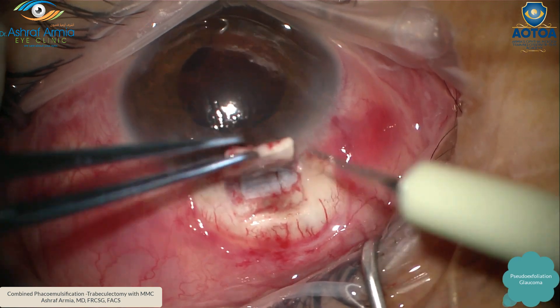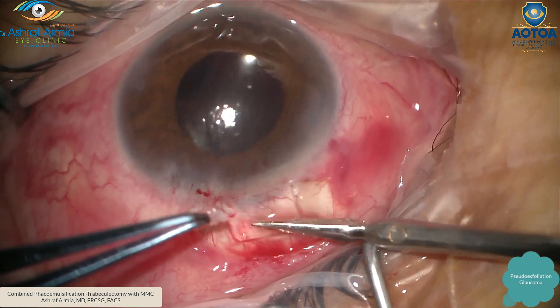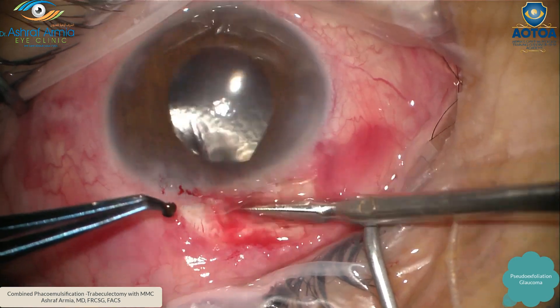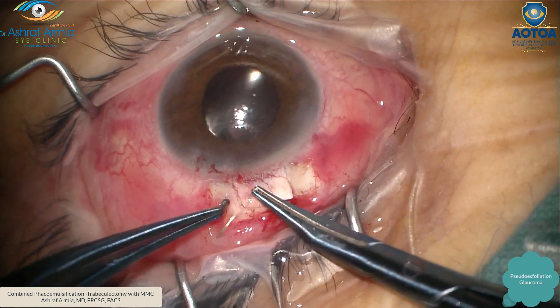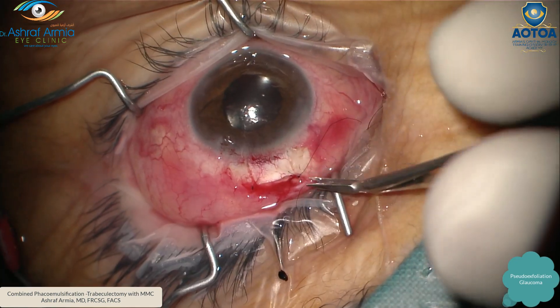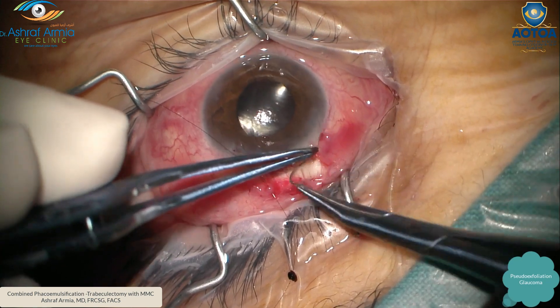With a good assistant — which is very important — to hold your flap with non-toothed forceps, you take your rectangle block which should include clear cornea and the blue zone. Then perform the peripheral iridectomy, milking the eye. I love to milk the iris from inside so the iris is not trapped in the opening. Then take two 10-0 sutures to close the scleral flap.